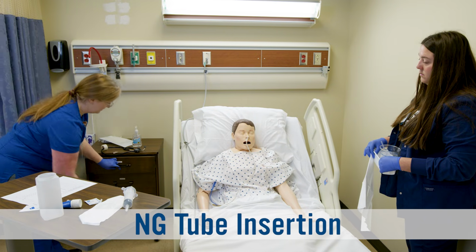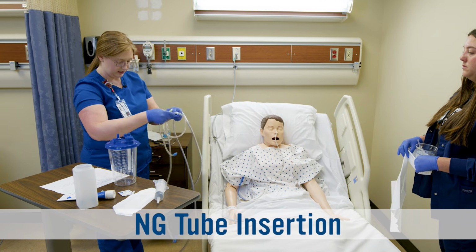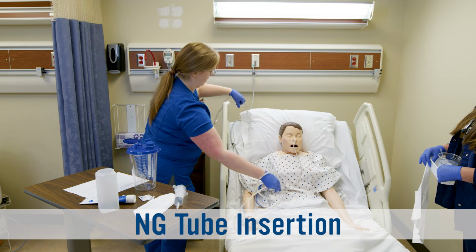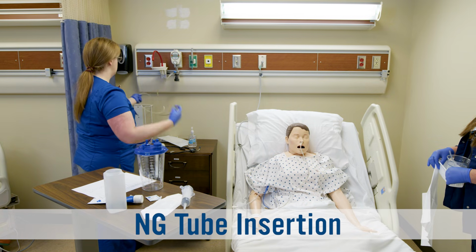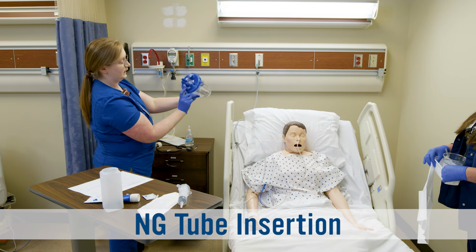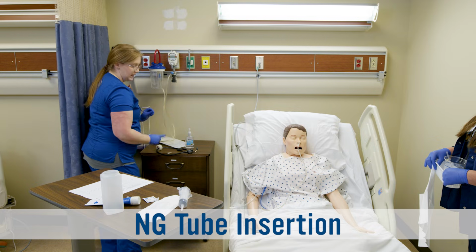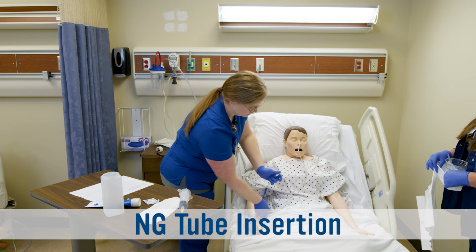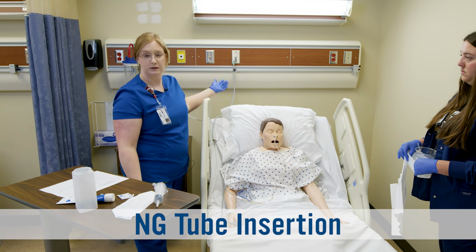So as far as suction, to set up suction for an NG tube, we have our suction canister. We have the connector to the actual container in the mechanism here, but then to our patient, we have another tubing. So we're going to go ahead and hook up to our vacuum and hook it up to the port here. Put our suction in here, and it says vacuum and it says patient. So we connect the vacuum, which is this red, to the vacuum port, and then where it says patient, that's when we connect the tubing for the patient. So we can go ahead and connect it, just don't turn on the suction till it's been verified by x-ray. That way, if we do get some backflow of stomach contents, it has some place to go.